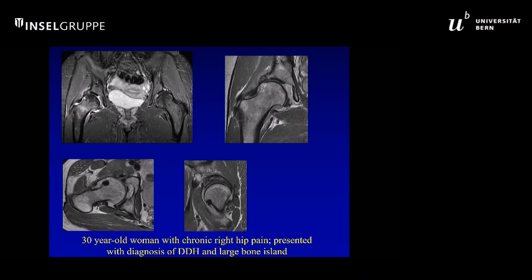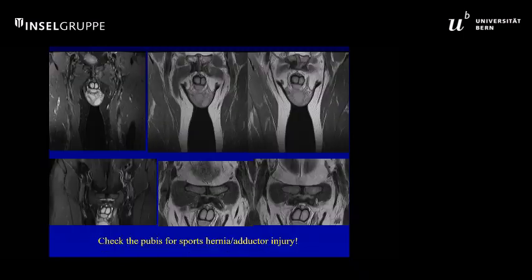And I love to do this with teaching, kind of to put it as an unknown. I'd love to be able to poll the audience, but this is actually, I'm sure someone already knows it, an osteoid osteoma, just a very large one. So it's important to think outside the box.